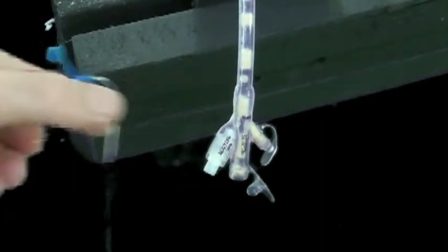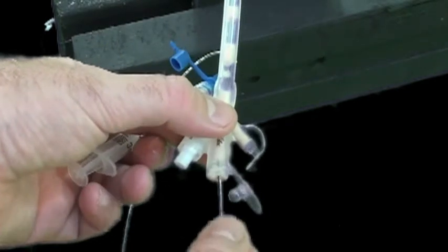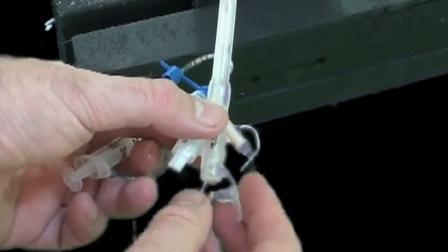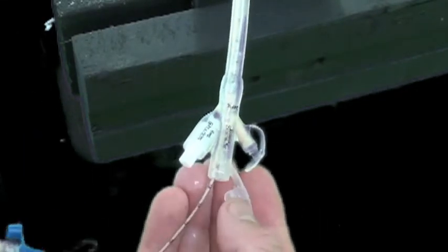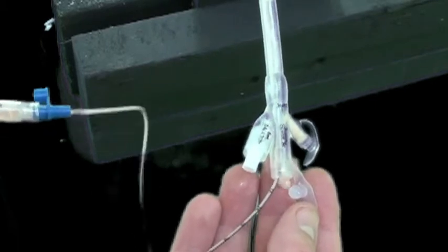Well, the cola will reach there eventually if you give it enough time, but I like to speed things along by sucking out as much of the feeding as I can with a pediatric feeding tube, like a 5 French. You can also use a really skinny suction catheter if you have one small enough, or even a really long angiocath. That tickles. Once you've got all the extra feedings out, you can use that same skinny 5 French feeding tube, whatever you got, to actually put your carbonated beverage back in the tube so it's right adjacent to the clog. Does it always work?